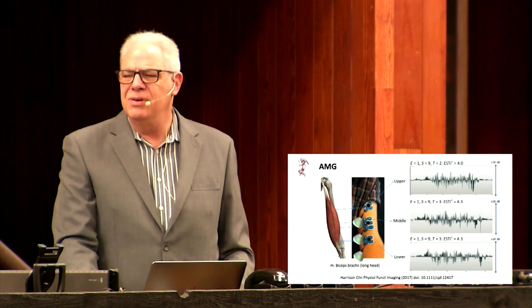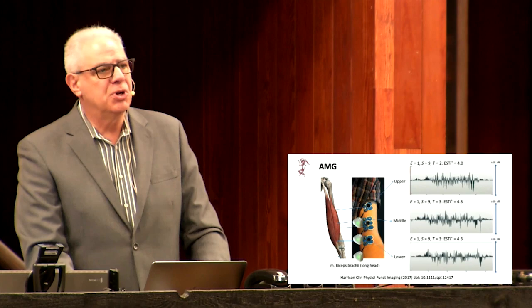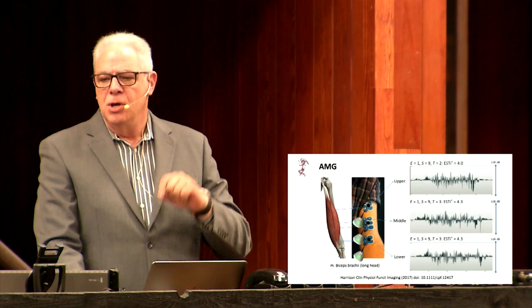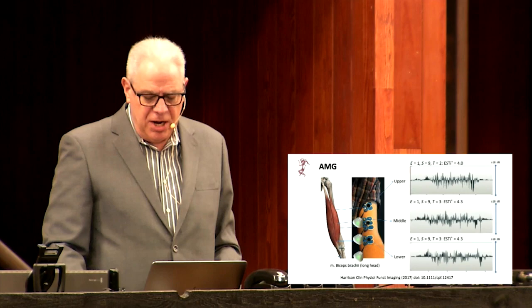And that is another advantage with acoustic myography because you do not need to be anywhere near as precise on the human. And certainly the muscle groups on the human tend to be smaller than those on the equine, although they are larger than the canine or the cat. But still, if you get it on the muscle anywhere, whether it's the origin, the belly, or the insertion of that muscle, you're going to be able to pick up an EST score that is essentially the same regardless of where you have placed the sensors. And so that is another advantage to this.